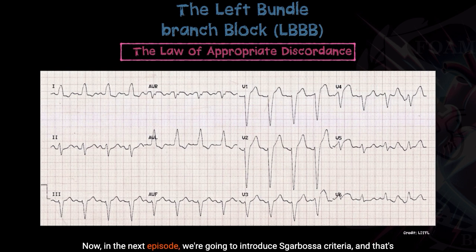Now, in the next episode, we're going to introduce Sgarbossa criteria, and that's the rules for what happens when we deviate from this appropriate discordance.